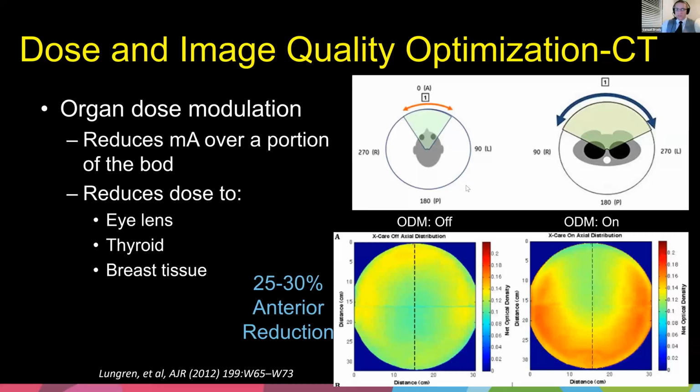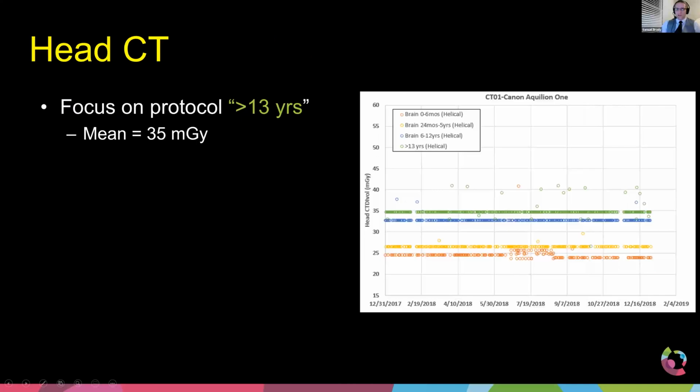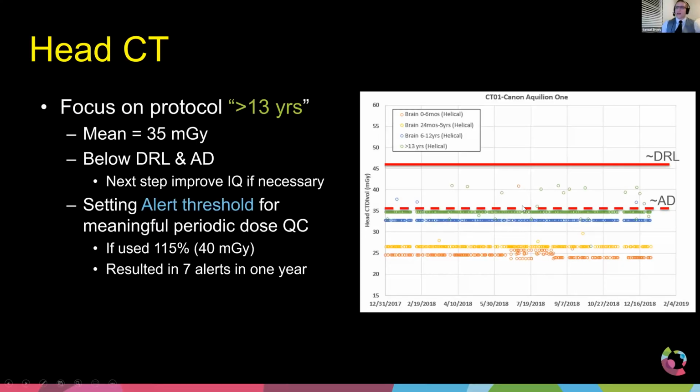For all other purposes, these little dots out here are high, and I don't know why they're high, but they're above this threshold. These values I only look at quarterly. The system collects them all, and then I plot my plots like this. Once a quarter, I meet with our dose optimization team and we review them. This is a retrospective approach, and it's a matter of asking, okay, what went wrong? Let's try to fix it. But like I said, if there's ever something that's really high, then the system lets me know.